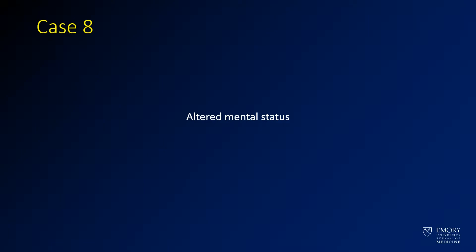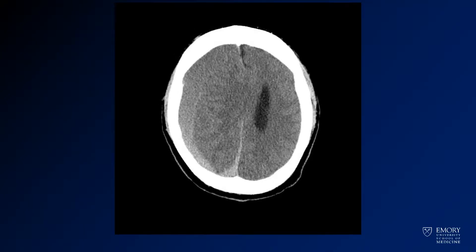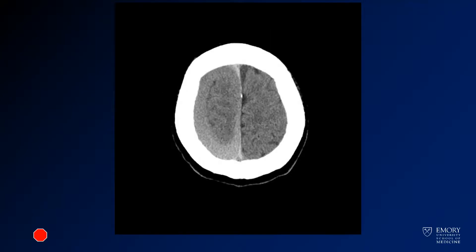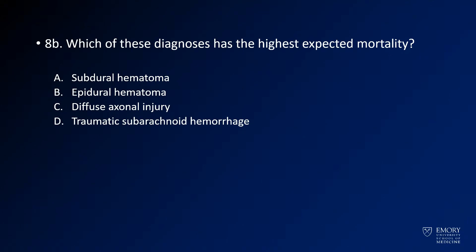For case 8, we have a case of altered mental status with no age given. Here you have images from a CT — just a couple more images that I'll toggle through for you. This is the last image. The question is: what is the most likely diagnosis? And which of these diagnoses has the highest expected mortality?